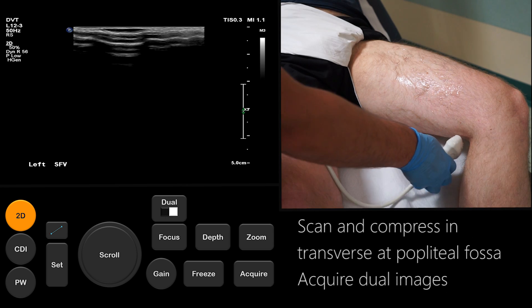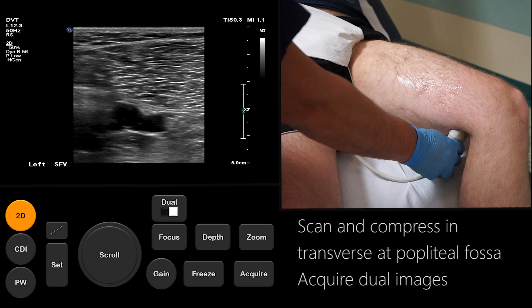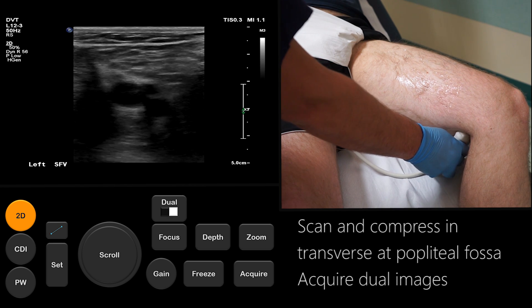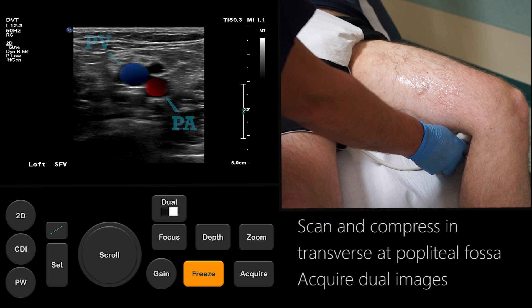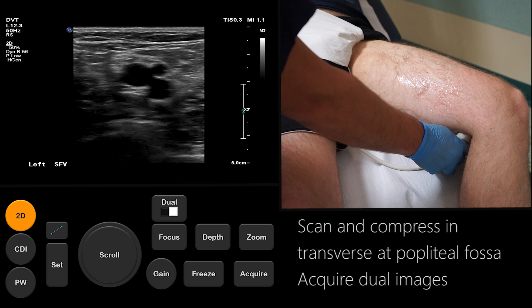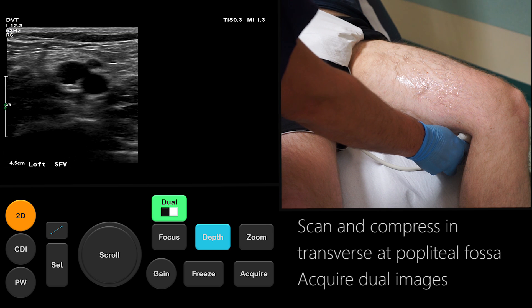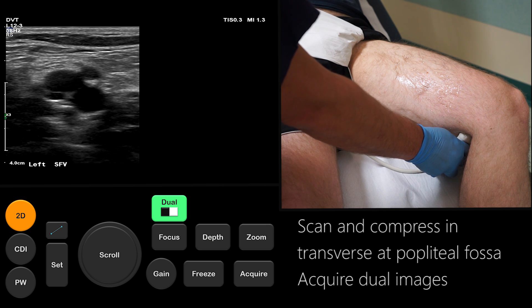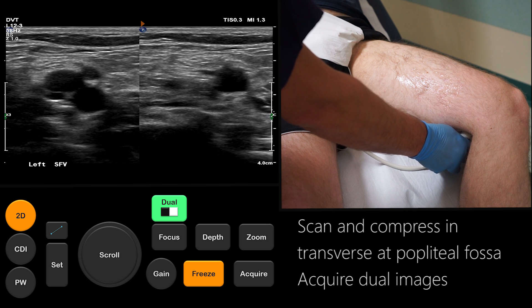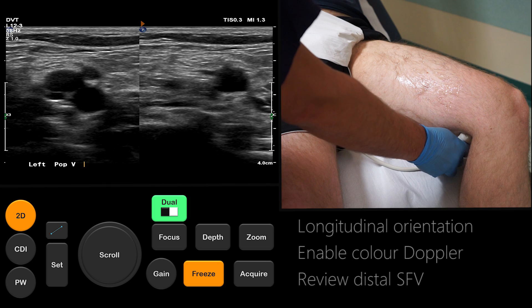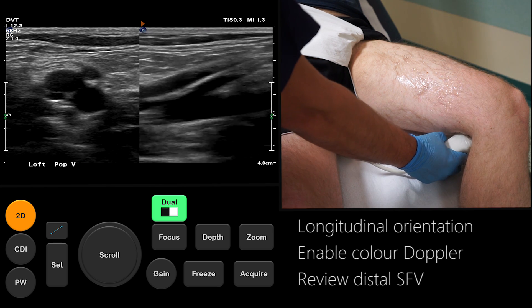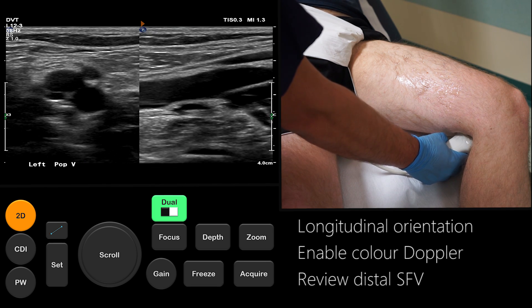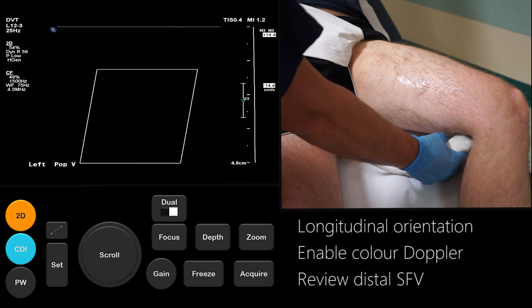The SFV becomes the popliteal vein after it exits the adductor canal in the posterior thigh. Place the probe in the transverse orientation at the back of the knee to view the popliteal vein, which usually lies superficial to the popliteal artery. Acquire a dual image of the popliteal vein with and without compression. It is also useful to acquire a longitudinal image with colour Doppler, as it provides a better viewpoint to image the distal superficial femoral vein.